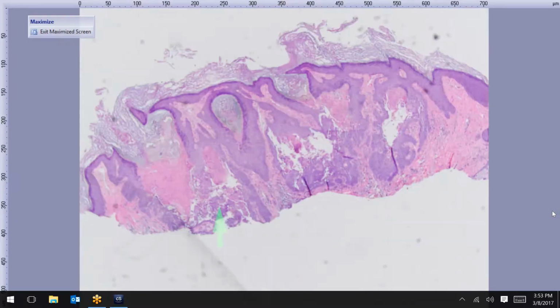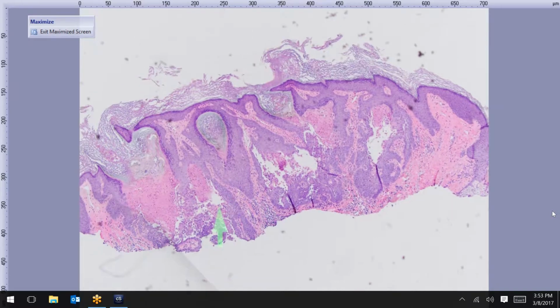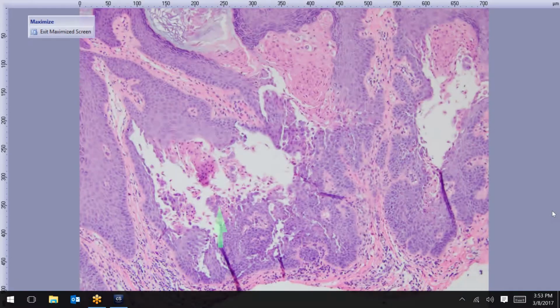All right, we'll go away from panniculitis now. We'll maybe mix in some more routine stuff here and there. Anybody, even at this power, like to put a guess in? Warty dyskeratoma, that's correct.